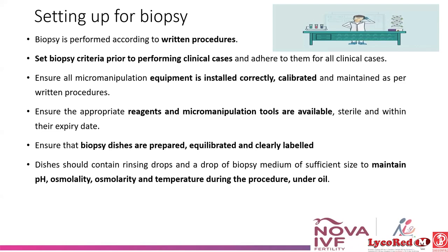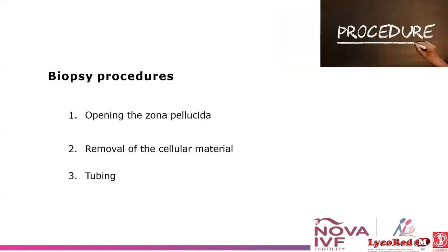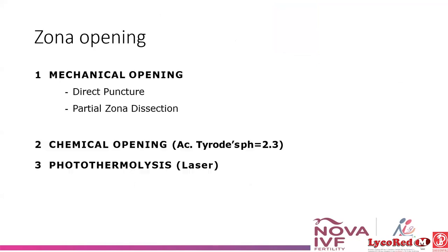And we have to do all the procedures like ICSI under the oil only, to maintain the pH and temperature, because this biopsy will take a longer time than the ICSI. Biopsy procedure has 3 points: opening the zona pellucida, removal of the cellular material, and tubing.